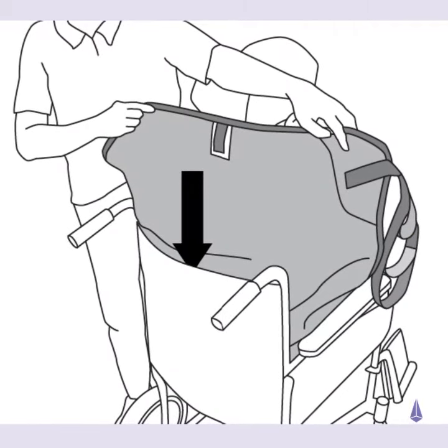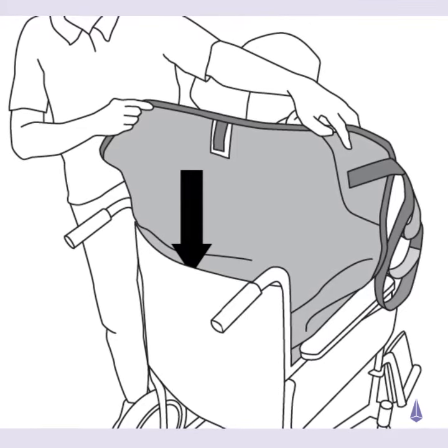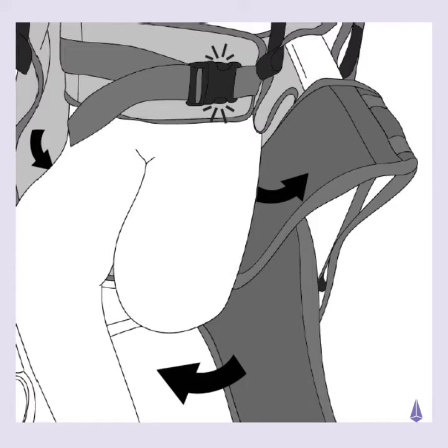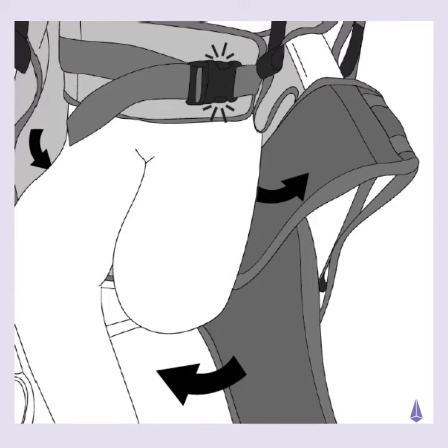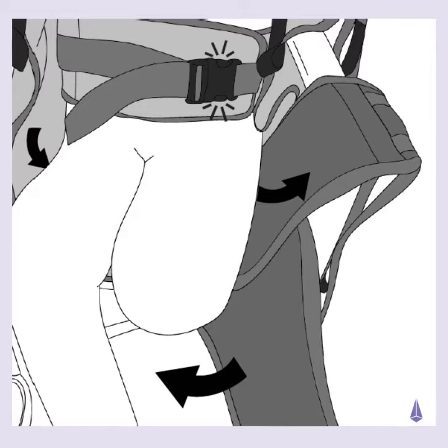With the sling label facing outwards, slide the sling fully down the back of the patient. Position the waist support at waist level, secure with the clunk-click buckle, and tighten using the webbing strap.